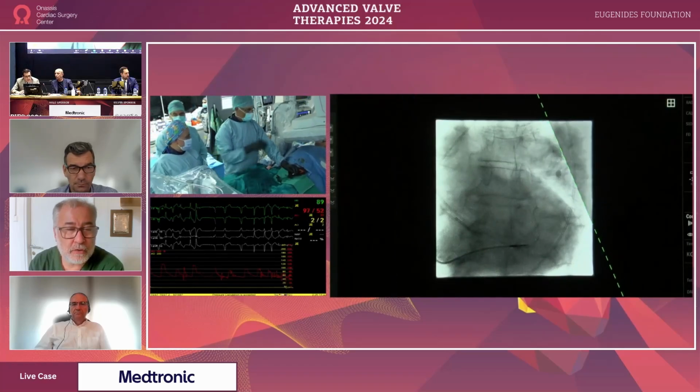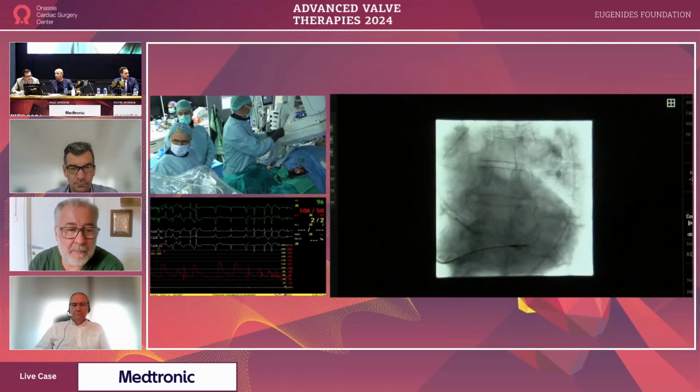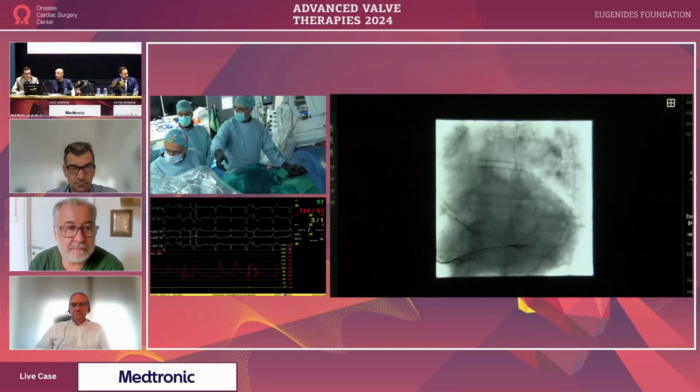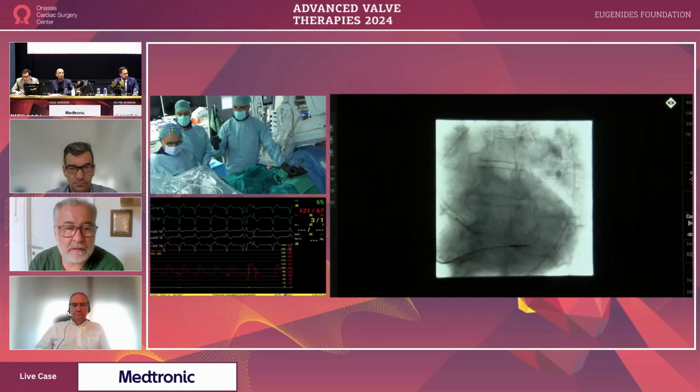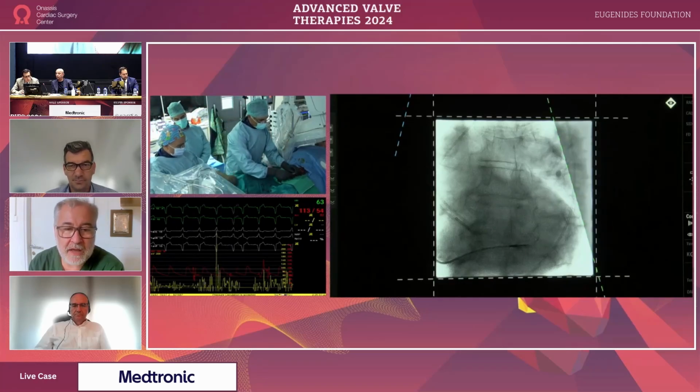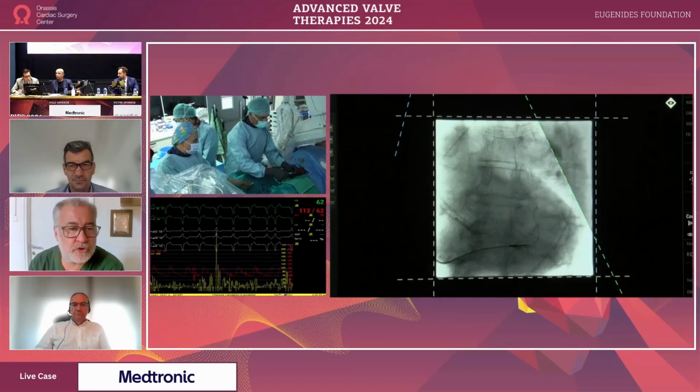Okay. So what we do is we combine the data we get from the CT with the fluoroscopy. Okay, we hear you. Go ahead. So that's the idea. There are also advantages to that. The advantage is we do not lose touch with the way we puncture or with the way we do crossover.